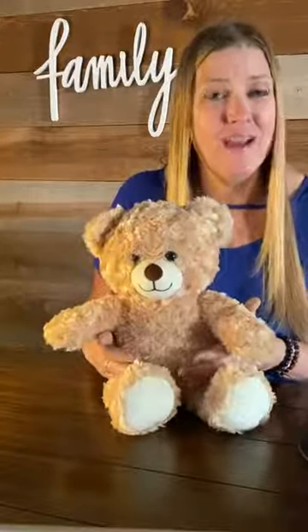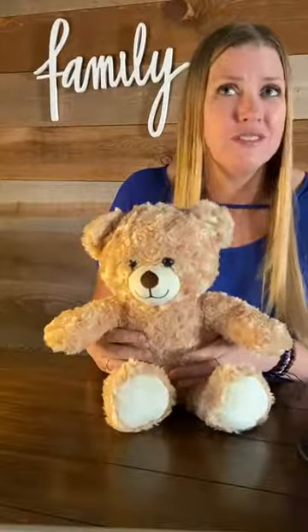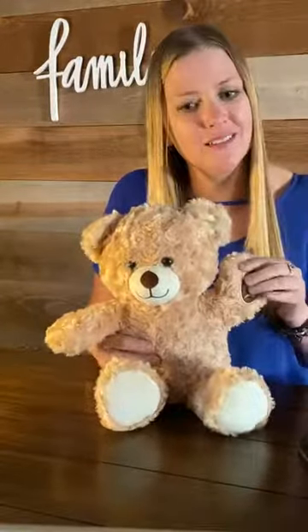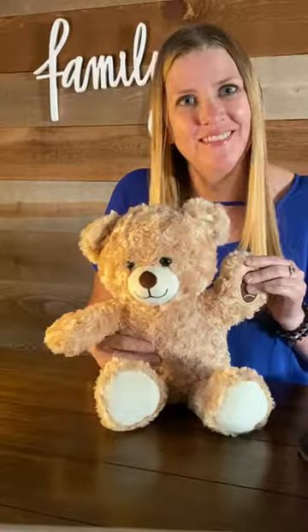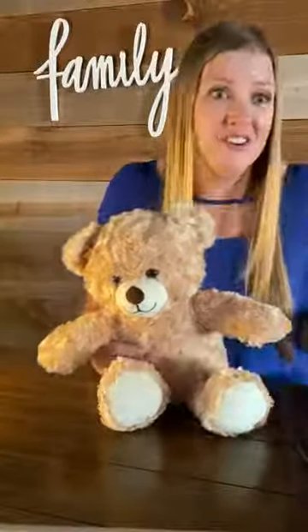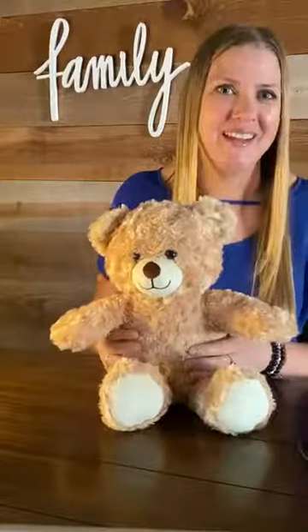In between questions, MediTeddy can also give you words of encouragement or just a nice greeting by pressing one of the paws, like this. Hi, I'm glad to see you. That's all there is to it. Now enjoy your new MediTeddy.